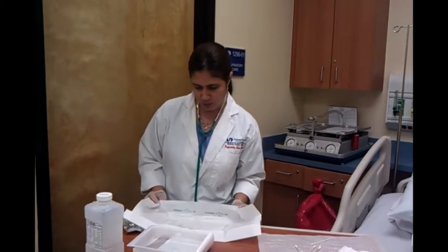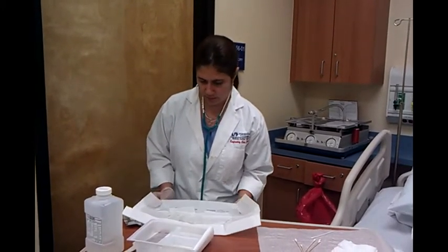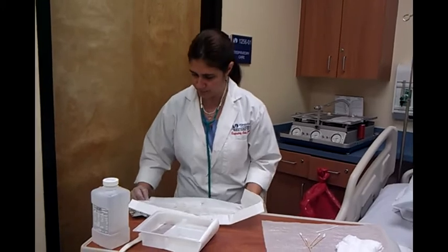I have to use the appropriate technique to put on my sterile gloves.